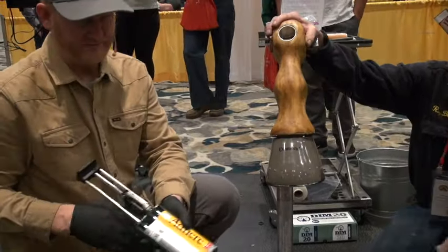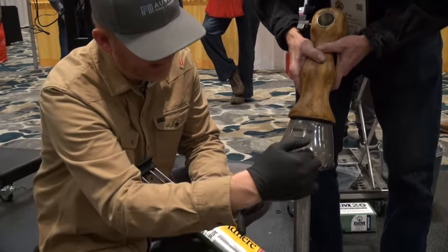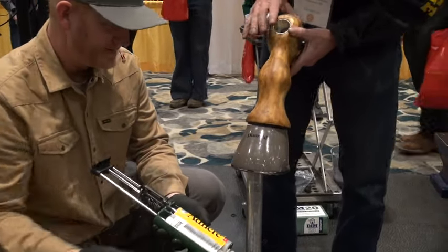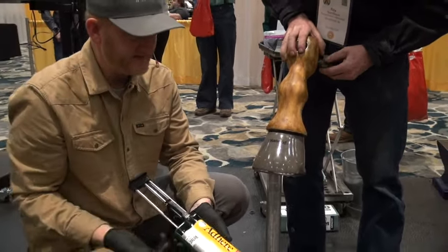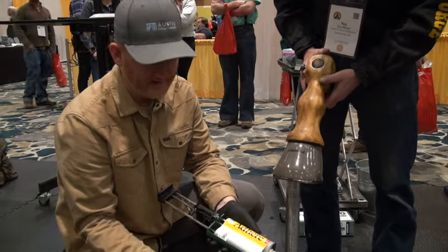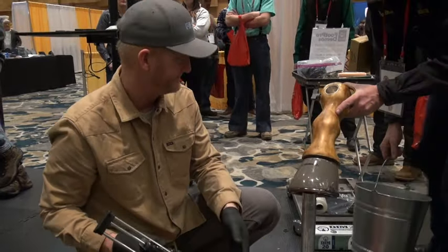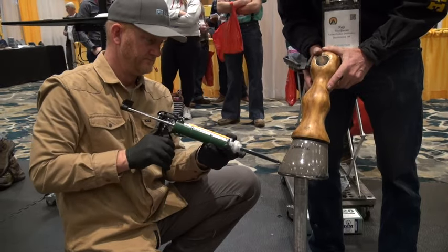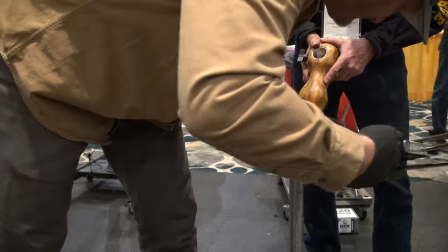I always go in with a bead of adhere super fast prior to putting it on. I just put a bead on the distal end of the wall and then I'll wrap it with the urethane wrap after I put the cast on. That urethane — the adhere super fast — just helps everything stay in place and helps it adhere to the wall. It will stay on for a little while, it will stay on for a few weeks. The resin in it will stick to the foot, but this is a little extra insurance and it will help it stay on. I'll just run a bead in there and that's all it takes.